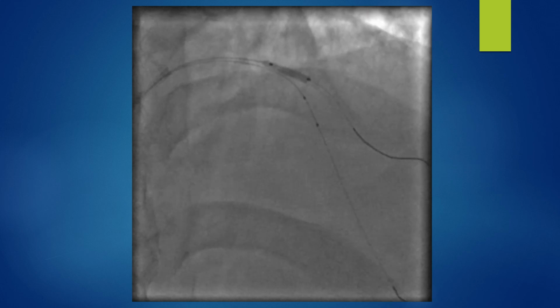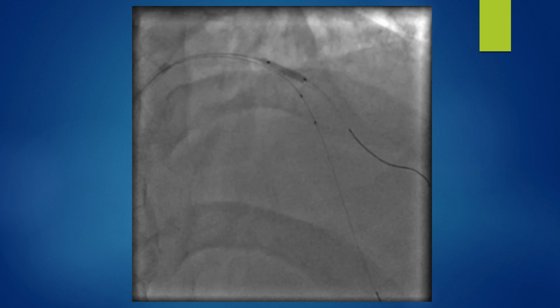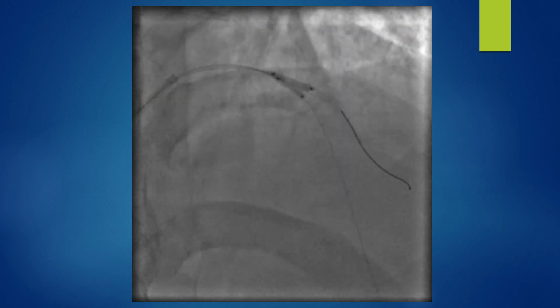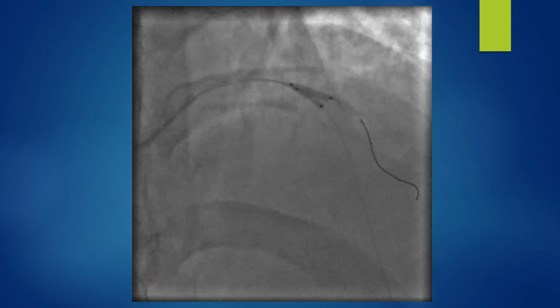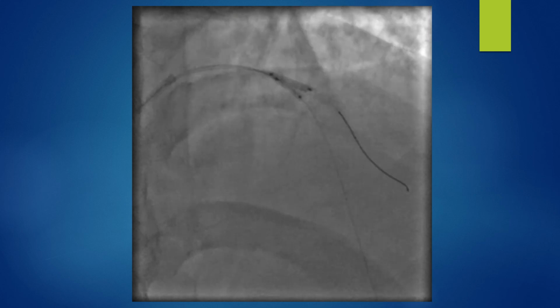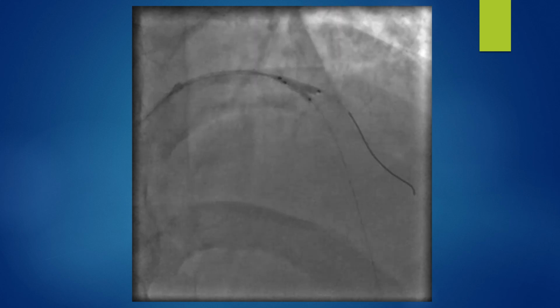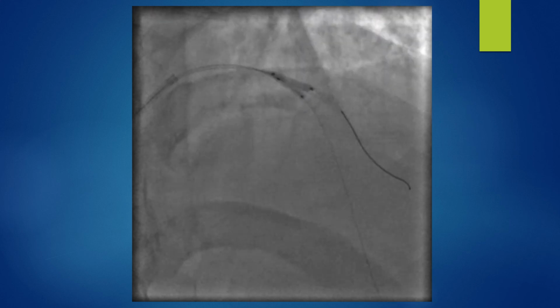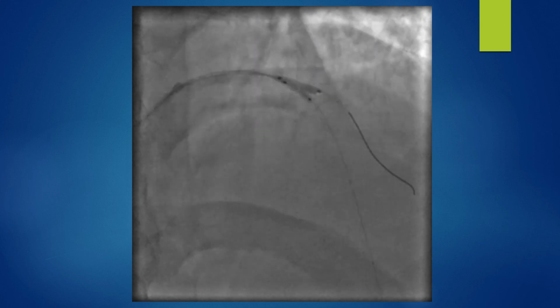Once I deployed the stent, I pulled back the diagonal branch balloon and flared out the ostium of the diagonal branch stent. The advantage of that is recrossing will be easier. Then I pulled back my LAD balloon and performed a kissing balloon with the stent balloon in the diagonal branch and then a 2.25 mm by 10 mm balloon in the LAD branch.